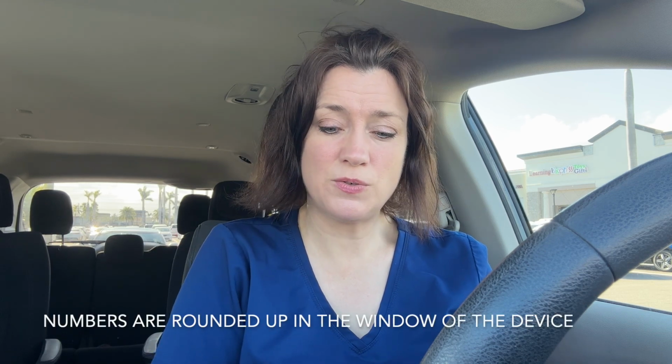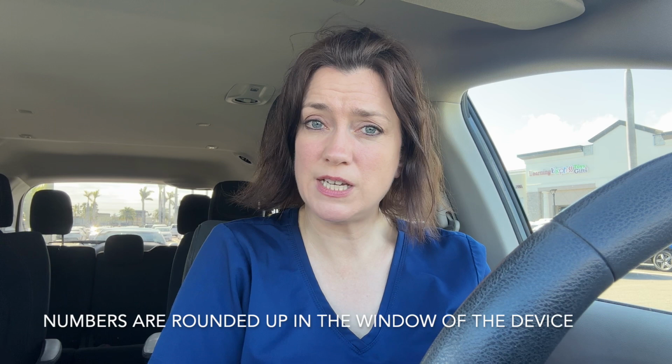I don't even know what I average when I ovulate. Maybe in the 30s, maybe 20 something. My estrogen is 287, which is pretty high. And my PDG is a 6. So did something come out of my right ovary yesterday? I don't know.